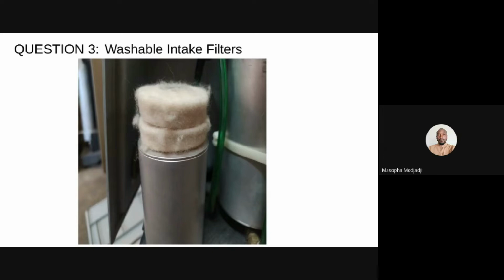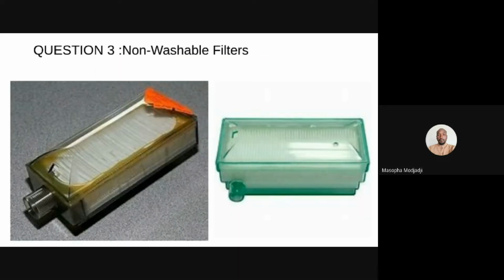Some brands, such as DeVilbiss 525, have non-washable filters. Do not wash this type of filter, as it could damage the filtration material and create health risks. These intake filters, if they are dirty, just replace them, as shown in the picture.